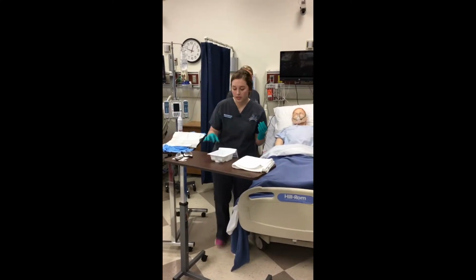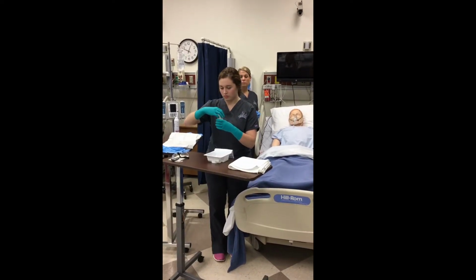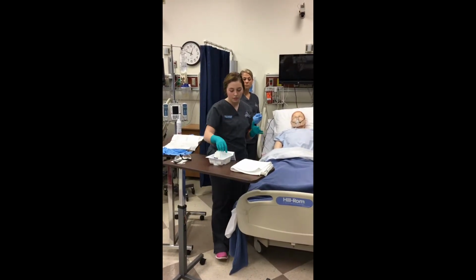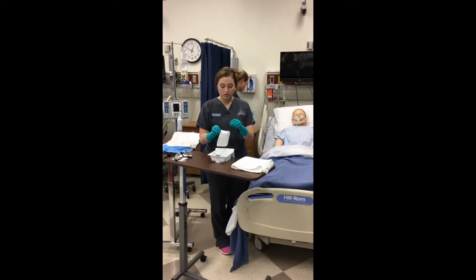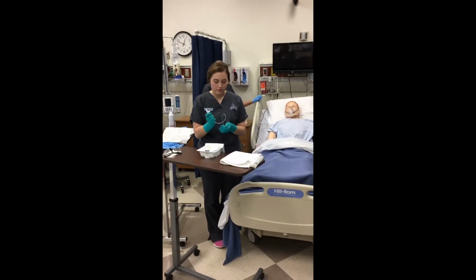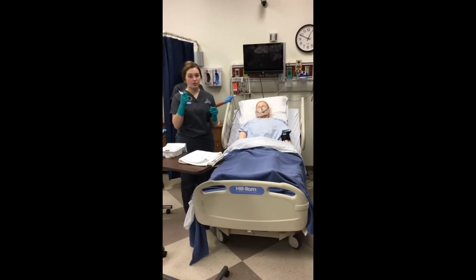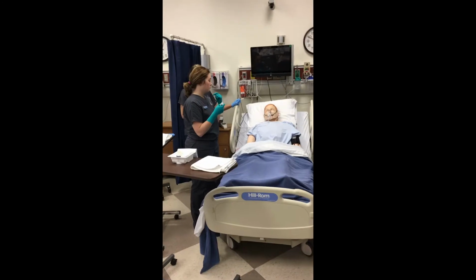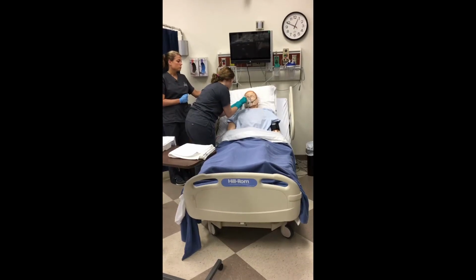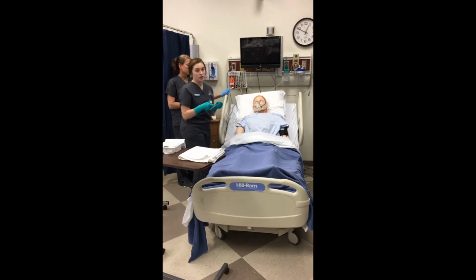Okay, now I'm going to take out my sterile water, or sterile saline, and open it. I am going to grab out my sterile suctioning catheter, and I'm going to use this to measure how far I need to insert it into the nare of my patient. And it's about 21 to 22.